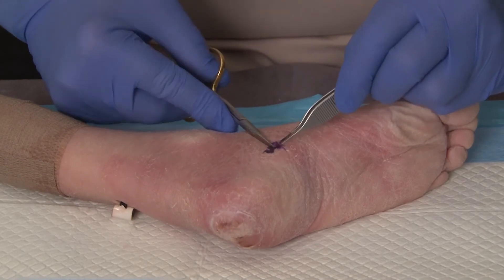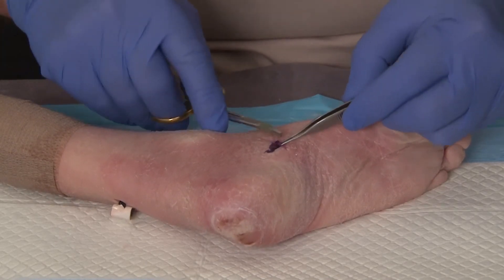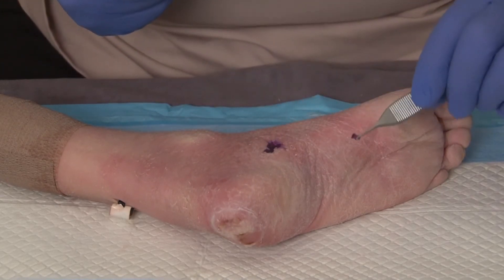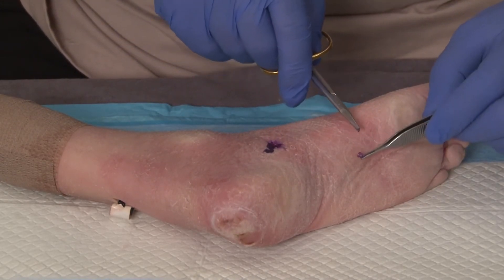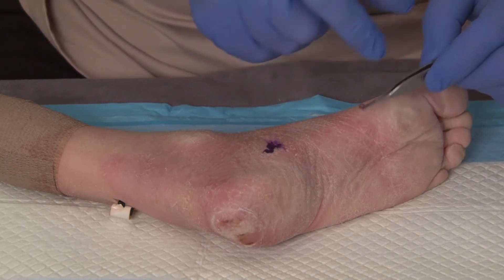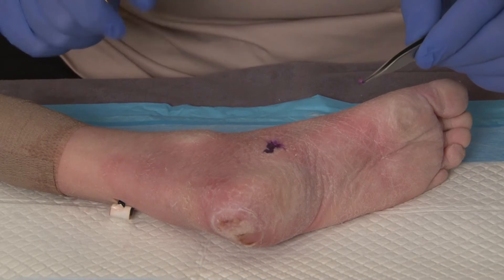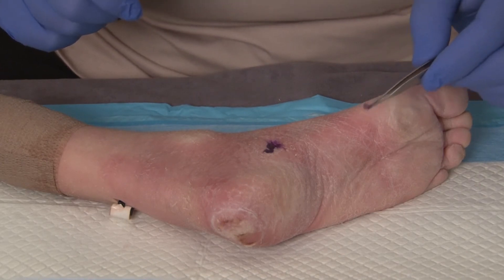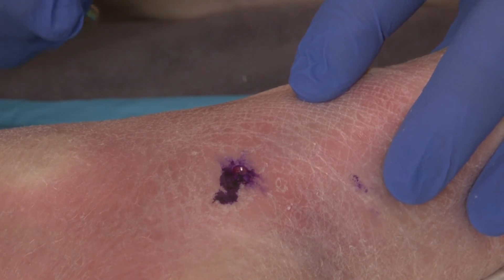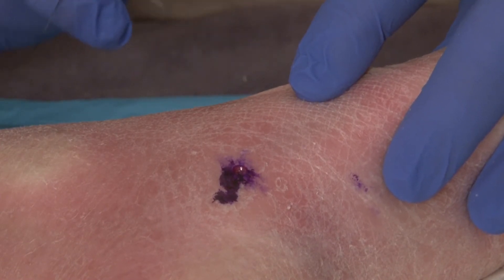Once the specimen is removed completely — now we have the 2.5 millimeter specimen — we will then put that into the specimen container and send it to the lab with the appropriate paperwork.